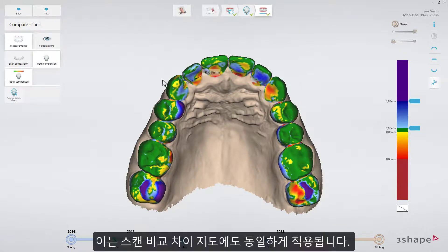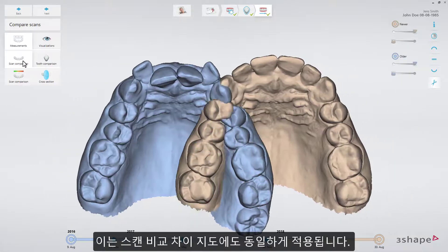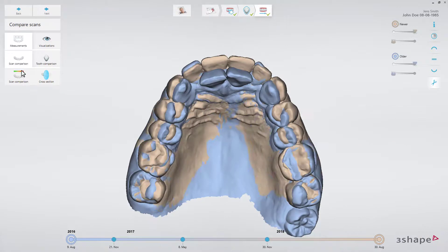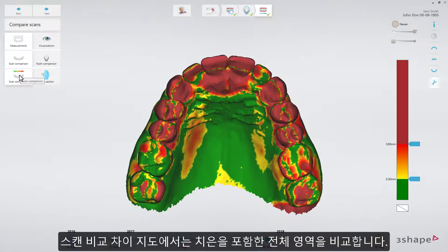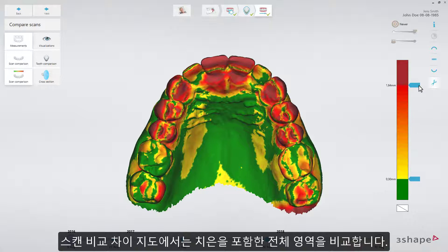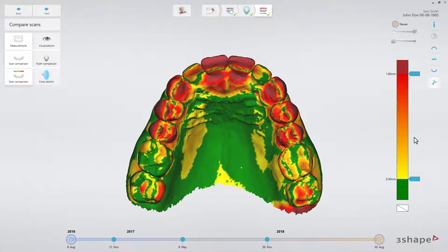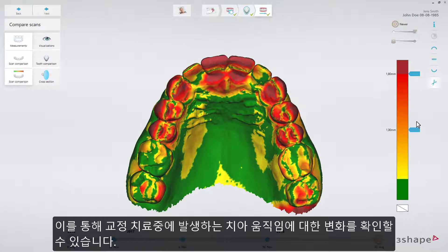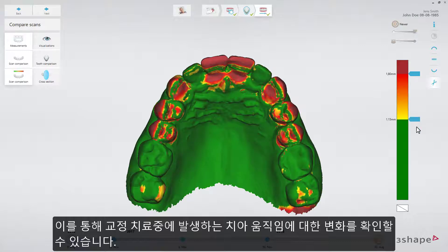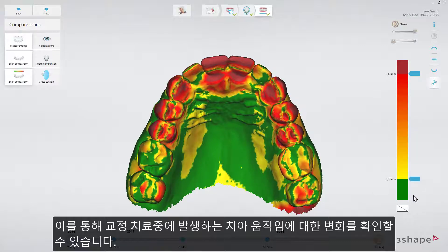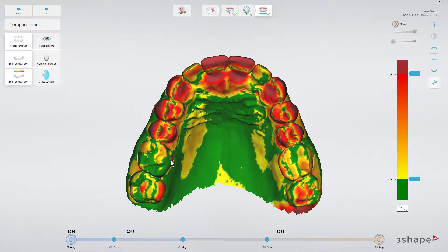The same applies to the Scan Comparison Difference Map. Note that the Difference Map here encompasses the entire model, including the gingiva. This enables you to see tooth movement changes, such as in orthodontic treatment cases.